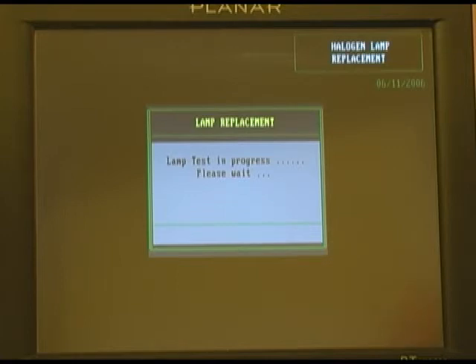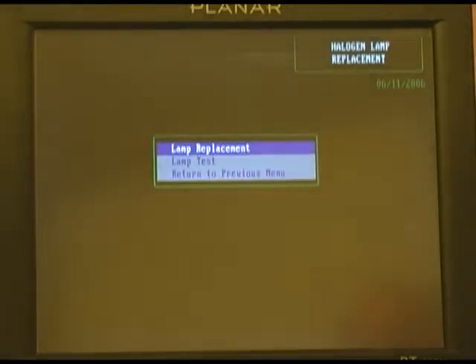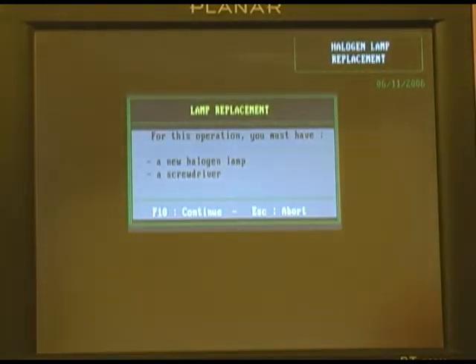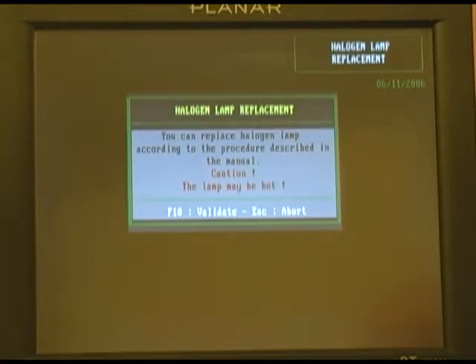optical filters that the instrument uses for various tests to get an optical density reading. If the instrument passes, it will indicate so and hit spacebar to proceed. If the test fails, move forward with the lamp replacement. And for this, you must have a new halogen lamp and a screwdriver. Hit F10 to continue.